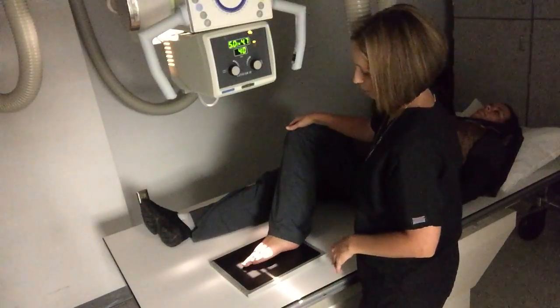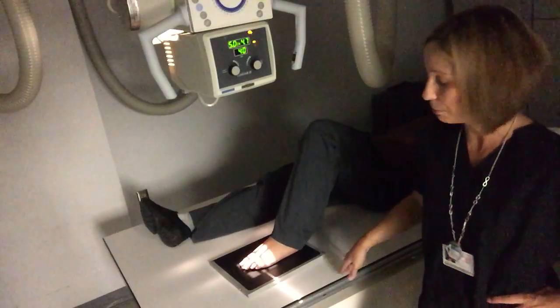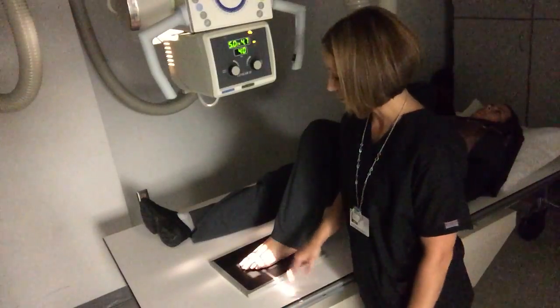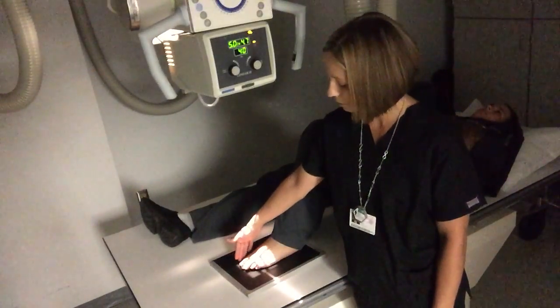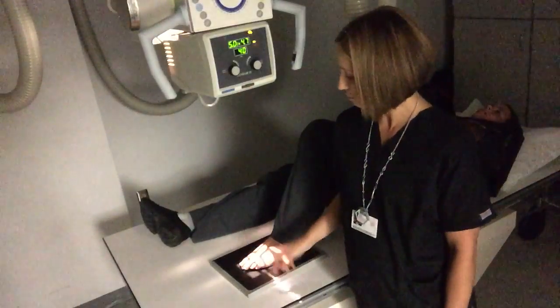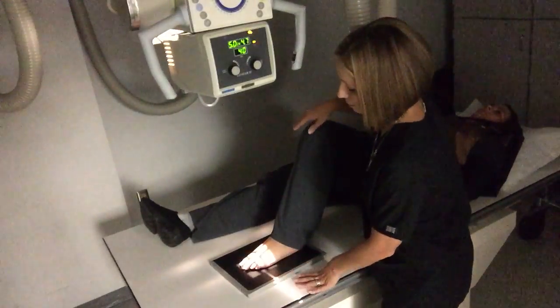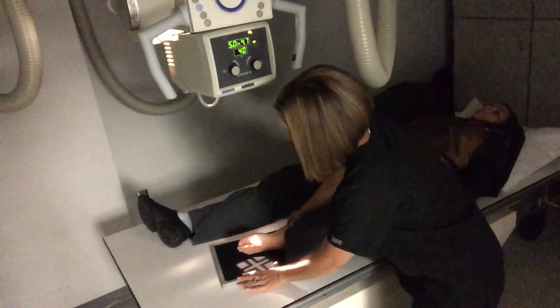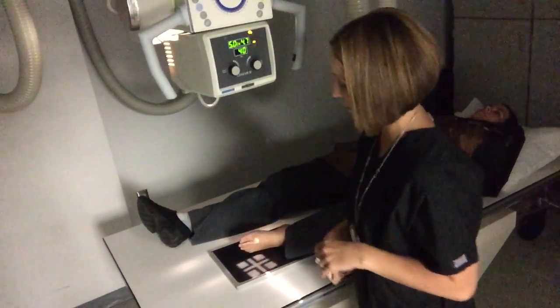For the lateral view, I'm going to have her turn her foot. It kind of depends on which toe is hurting — typically you won't do an x-ray of all the toes, just the one that's affected. Like with a finger, you want to get the affected toe closest to the IR. If it was her big toe, we'd put the big toe next to the IR; if it was her pinky toe, we'd put that one next to the IR. For this example we're going to say it's her little toe that's hurting, and she's going to roll her foot all the way over.